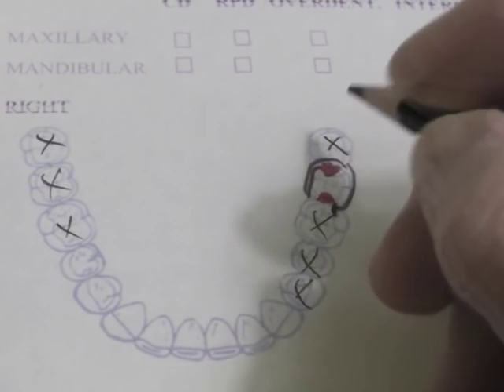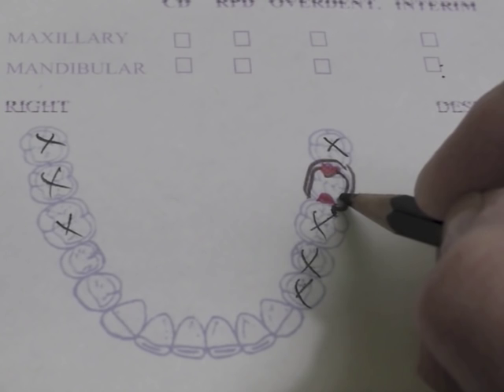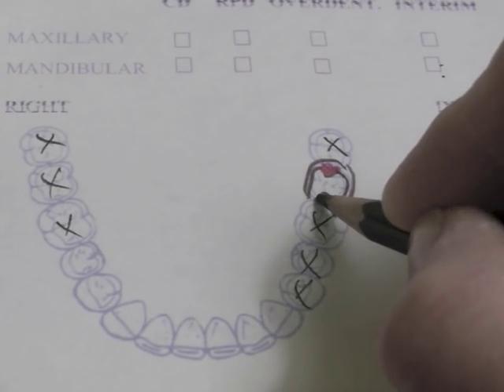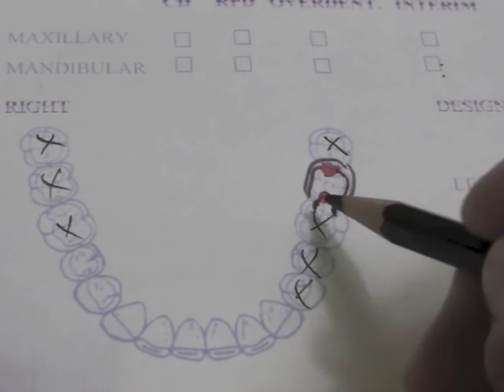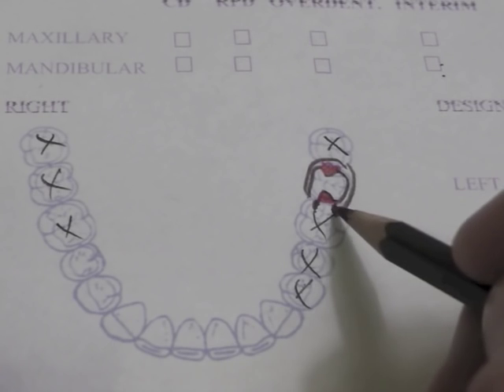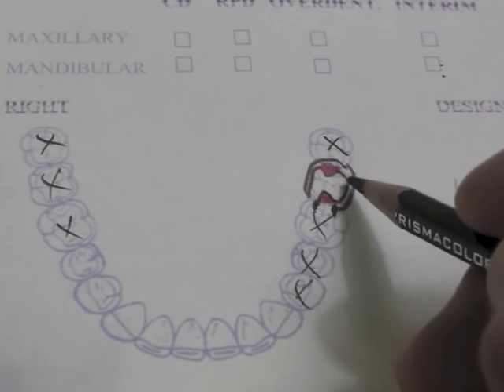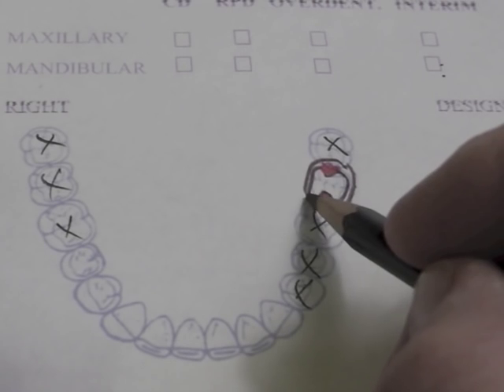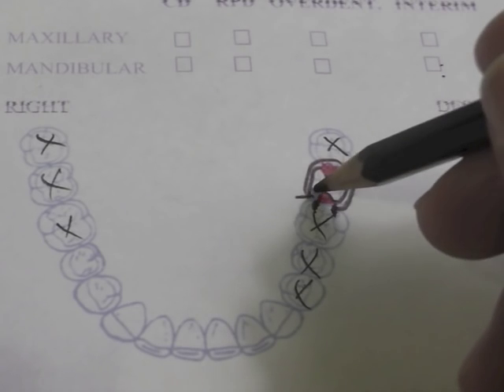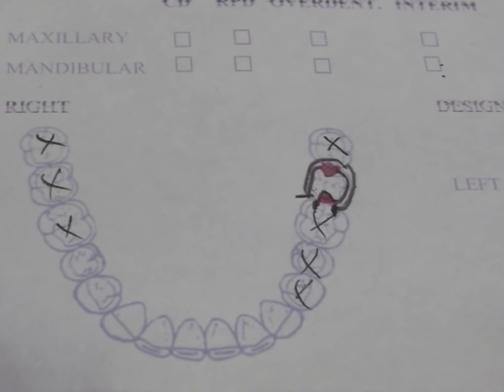Our direct retainer arm is on the lingual aspect, and our reciprocal arm will be on the buccal aspect, and that will come down and become a guide plate. This guide plate goes all the way up to this rest, and this guide plate goes up to the bottom of the reciprocal component. This will be in the middle third of the tooth. The first two-thirds has to be above the survey line, and the last terminal third will go under our survey line, because this is the greatest undercut, and it requires us to do the least amount of adjustment on that tooth.